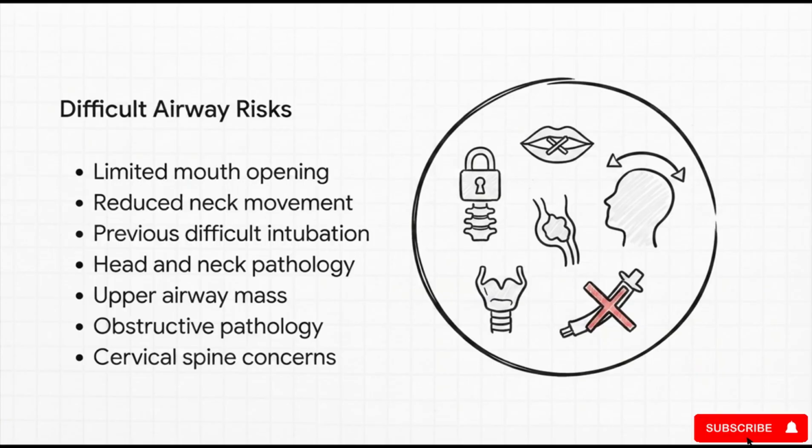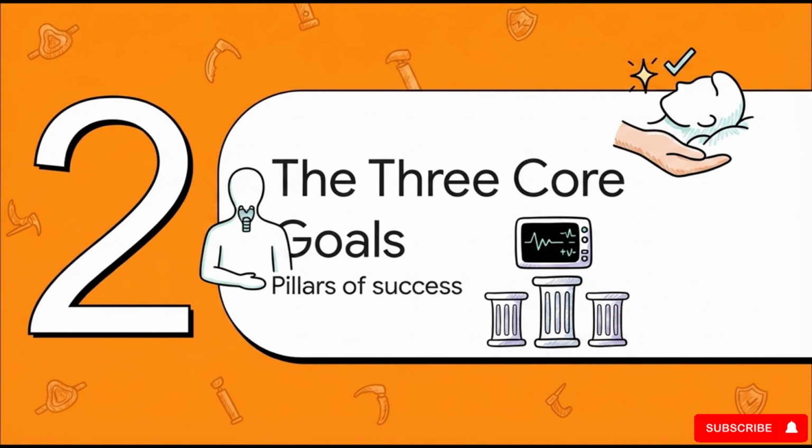The key takeaway here is that this decision always stems from a comprehensive airway assessment. You're looking out for that dangerous combo, a difficult airway paired with a high risk of losing ventilation right after induction. Moving smoothly along to Section 2, the 3 core goals.